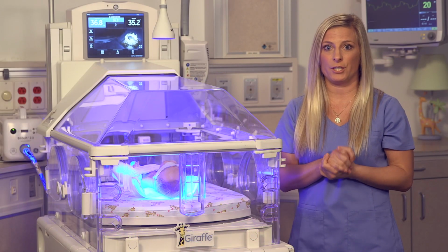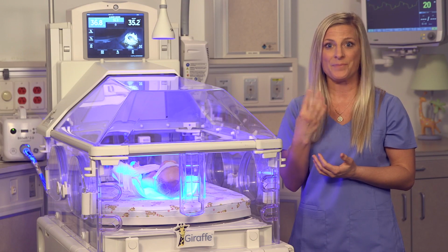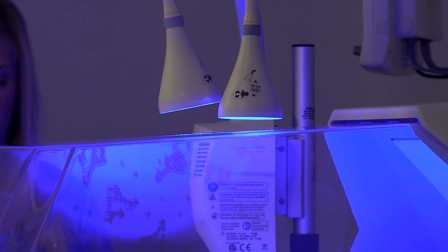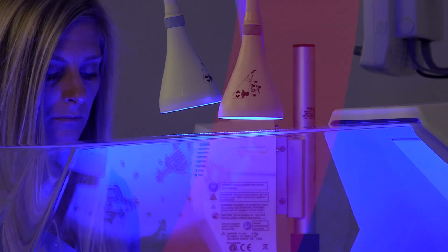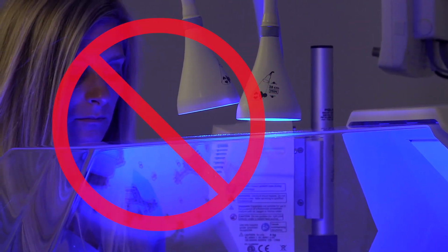So the wrong application of double phototherapy is thinking that 2 + 2 = 4. For example, if you use 2 overhead lights that both have an irradiance of 20 microwatts per centimeter squared per nanometer, you may see a nominal increase in the irradiance level, but you will not see it increase to 40 microwatts per centimeter squared per nanometer.